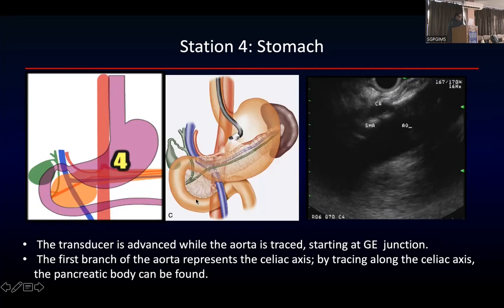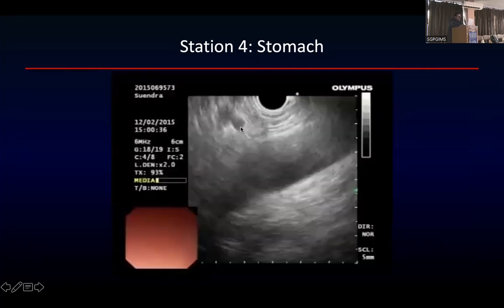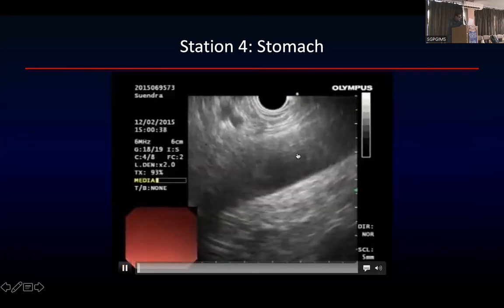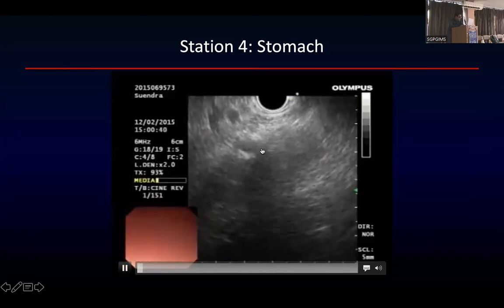Okay, very important. Position scope कहाँ है आपका? Scope आपने यहाँ पर रख दिया. Aorta है ये. Aorta से ये निकल रही है celiac और SMA. आपने स्कोप यहां पे रखा है. So how do you do this? If you see aorta and then celiac. Can you see the celiac? This is the celiac. This is aorta. This is celiac. And celiac के just नीचे SMA है. Okay? Aorta, celiac.